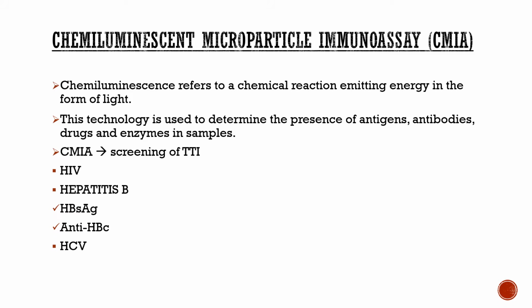For hepatitis B at our institute, we are testing HBsAg antigen and anti-HBc antibody. And also in the machine, we have the option for testing syphilis. According to our institute's requirements, we can customize the transfusion transmitted infection testing.